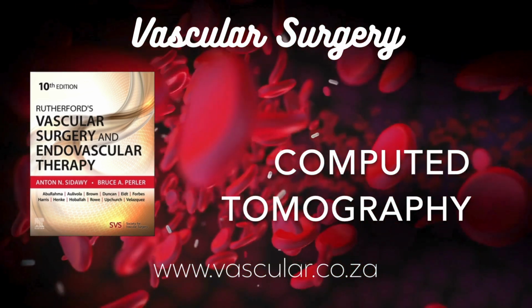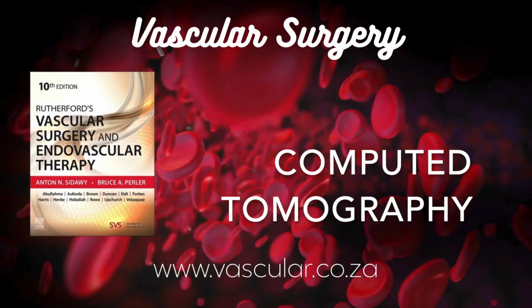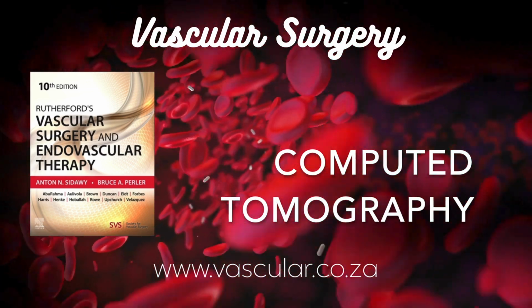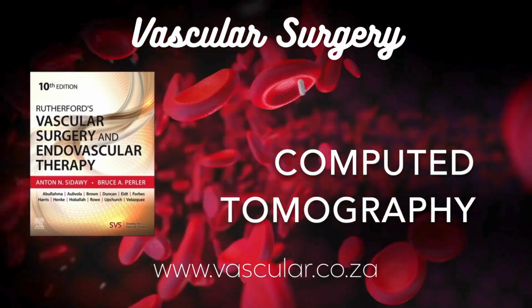And these are fixed once the scan starts. You can't change them later. That's right. These are acquisition parameters. Once the raw data is acquired, it's acquired. You can process it differently afterward, but you can't change how it was originally captured. That's why getting the protocol right beforehand is crucial.